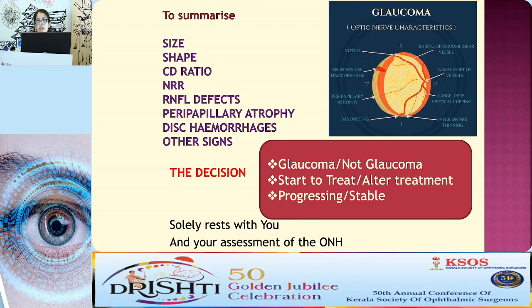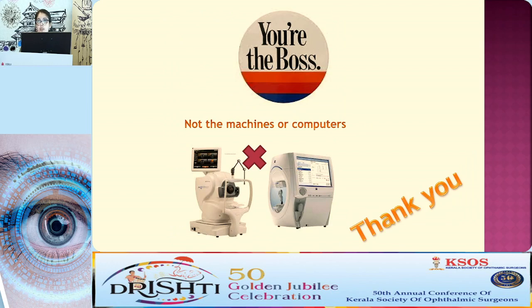Or even, as Thomas Sir said, we may find out other causes of the field defects and OCT defects, like a toxoplasma scar he was showing. So the decision solely rests on you. Remember always, you are the boss, your clinical assessment is the best. Don't totally depend on machines or computers. They are just there to help you. Thank you so much.